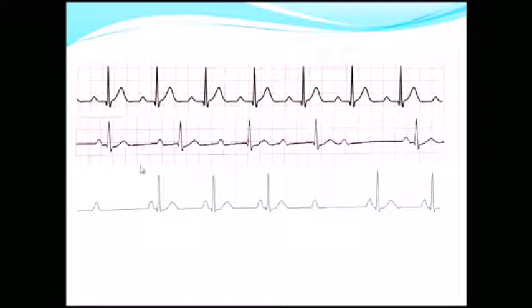So the difference between these two is that you still have a P wave that is not followed by QRS, but your PR interval does not prolong. Okay? Now the reason they make a distinction between type 1 and type 2 second degree heart block is because it has implications for clinical practice. And that is, you need to pace second degree type 2 heart block. Okay? So remember, this can be a normal rhythm. So patients that have this might not necessitate pacing, but patients with this will need pacing.